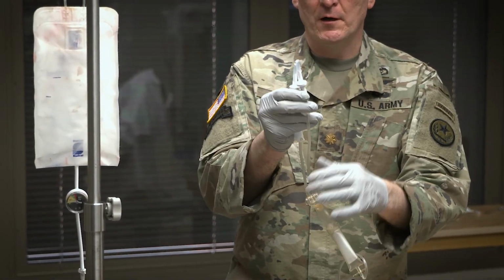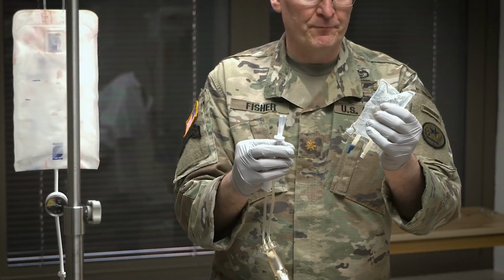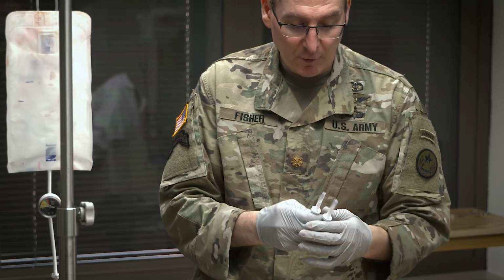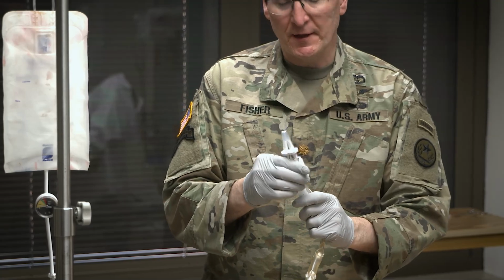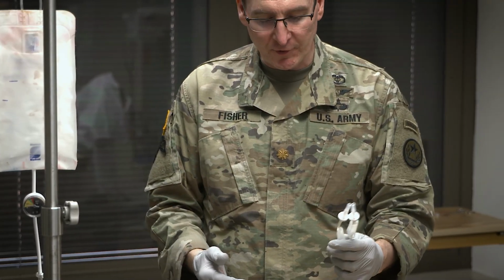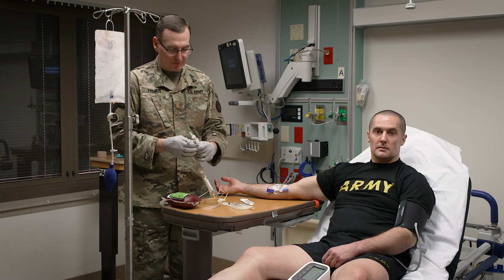These are for, one for saline or any sort of sodium chloride, or you can use Plasma-Lyte. But the other one is for your blood. When using whole blood, you don't actually need the second port, but based upon how your medical direction prefers, we're going to go ahead and use it as though it is required during this session.